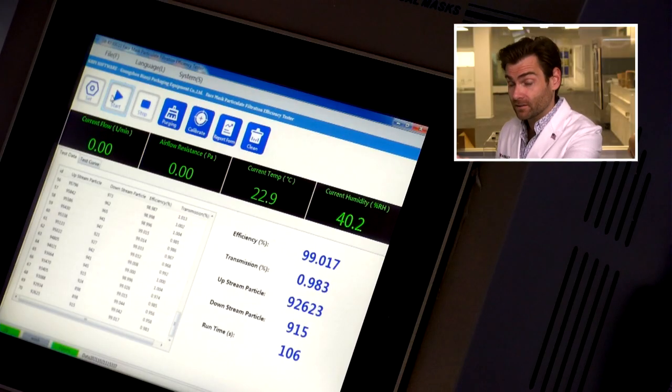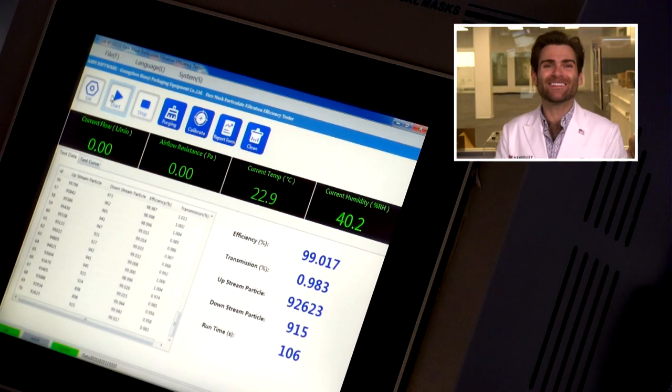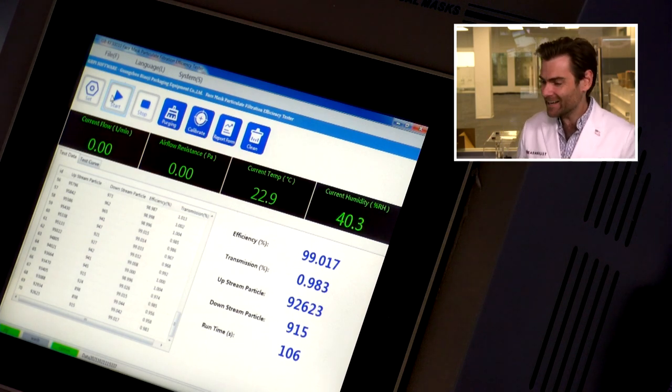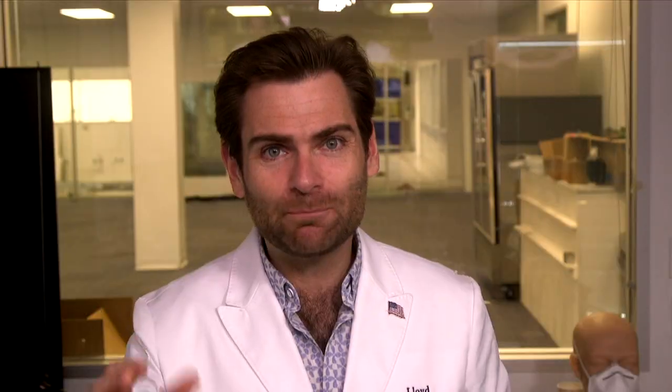Remember, an FDA 510k cleared ASTM Level 3 mask needs to hit 98% filtration on this machine. Wow — there it is. This is the mask of the day: 99.017%. Finally — I just tested probably five or ten FDA cleared masks that weren't even clearing 90%, pun intended. So happy to find a mask that is actually beating the standard.